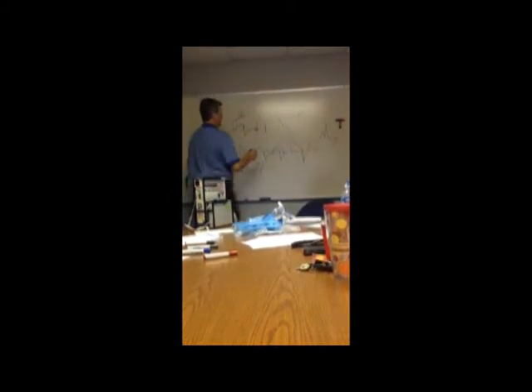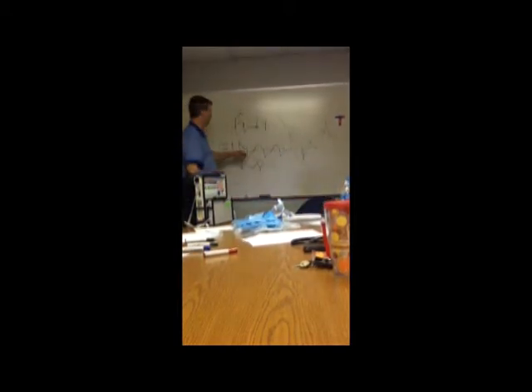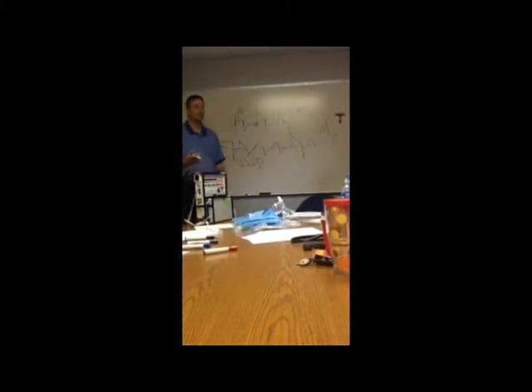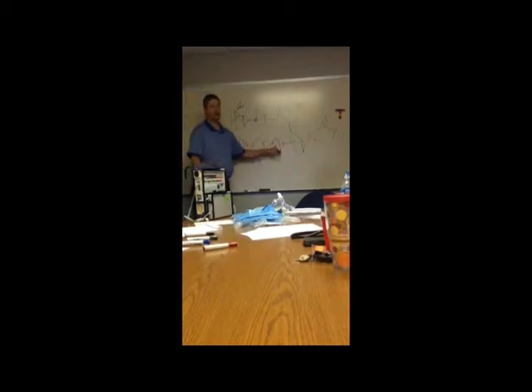Yeah. Should be. All right, so that's assist control, that's IMV. The reason it's good to change to assist control: if I'm on IMV and I'm working hard, I'm getting 8 breaths a minute where the machine is doing all the work. So I don't have to do anything but just make it start. But on the other breaths, I actually have to suck negative pressure through the circuit. I have to make that circuit pressure drop for air to come to me. So I'm working on these breaths. That's why we used it to wean people. We would let them make sure they were getting enough every minute that they didn't get in trouble, but we made them work their muscles, okay?